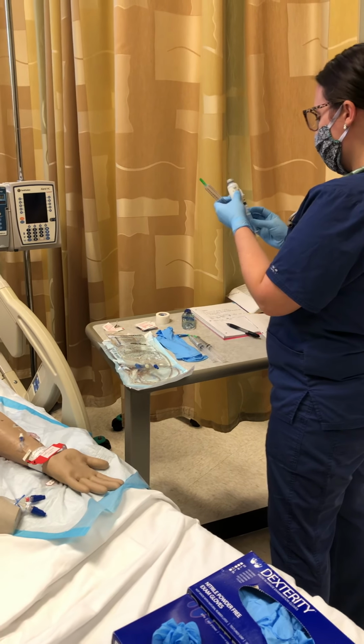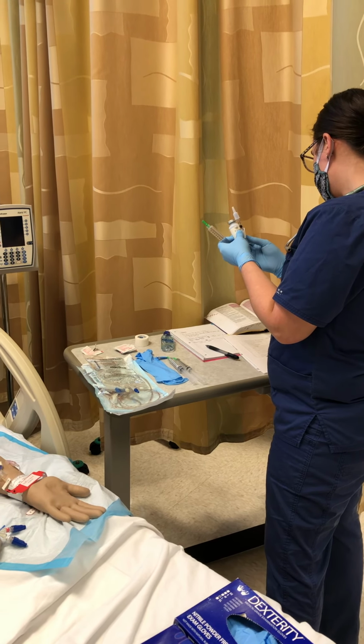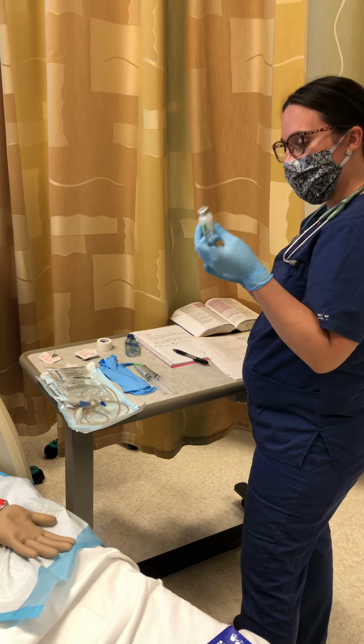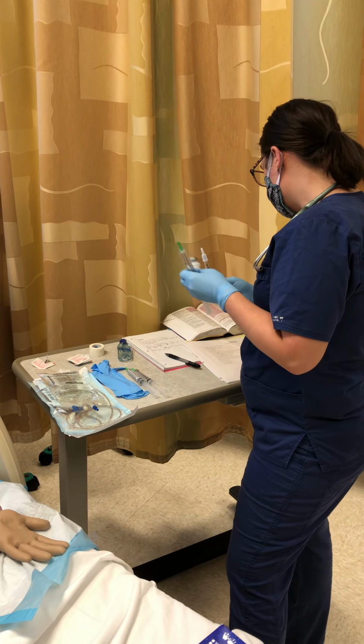He's getting furosemide, 1 ml, due right now. Again, I have Eugene Williams. He is getting furosemide, 1 ml. Actually, I wouldn't have this in the room if this is labeled. But that's okay. I brought it in with me.